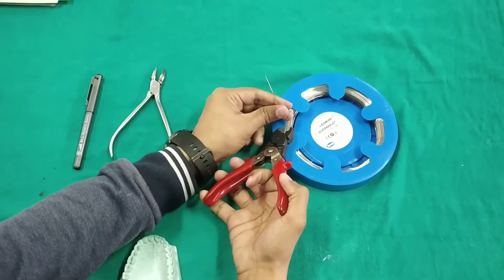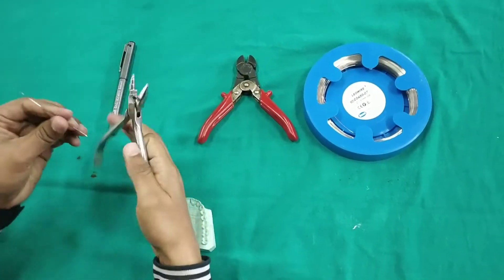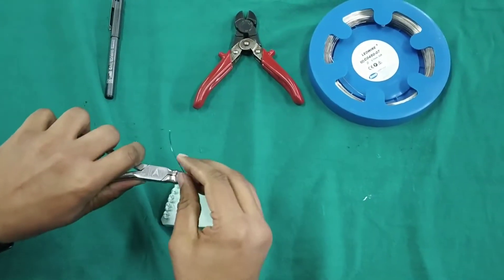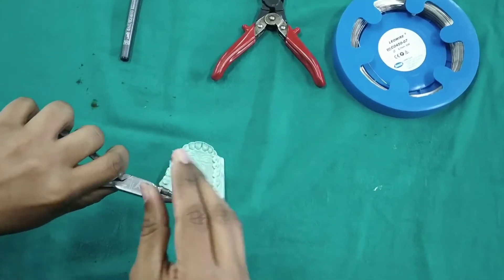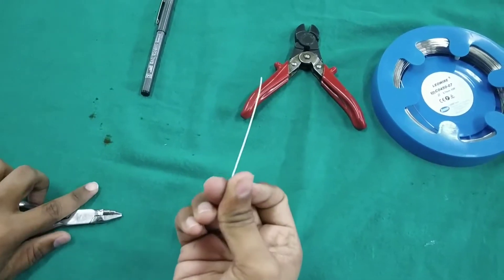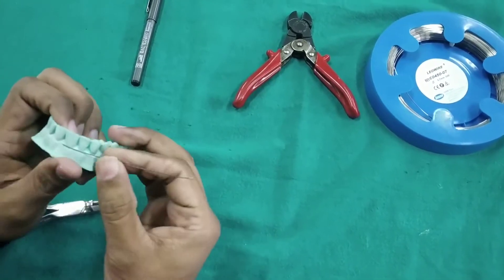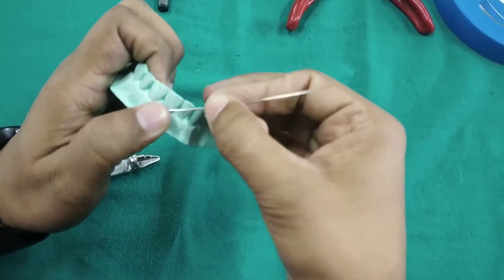First, we cut an appropriate length wire and straighten it. Now the wire is adapted to the cervical undercut of the tooth and then to the disto-buccal embrasure.